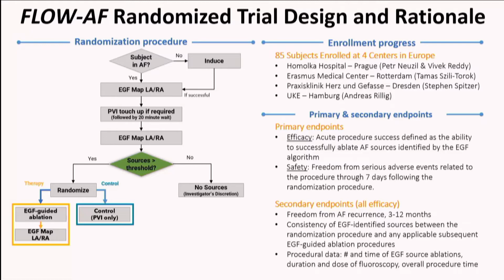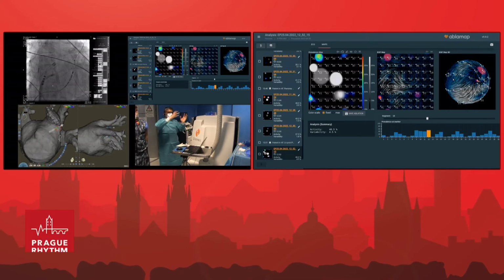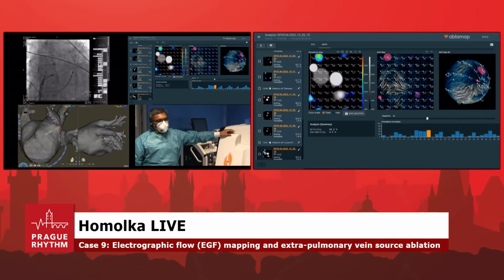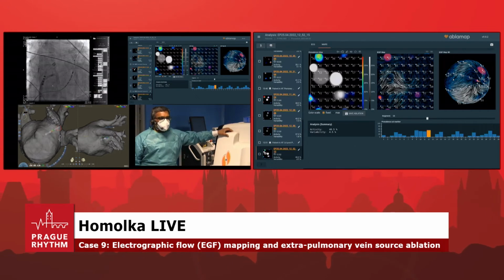Okay, so right now, what are we doing? We're still acquiring more? So, okay. One of the issues is that the Topera basket is not perfect, as we're all aware. Because it's not perfect, we basically take the basket, put it in one position, and move it over to this position, and then get a couple of different recordings. So while I say it's global, it's probably largely global, but not exactly completely global.